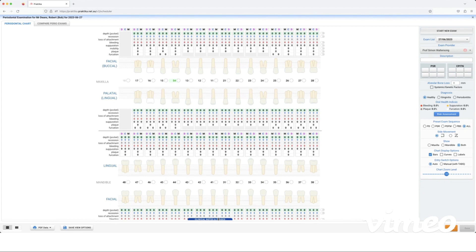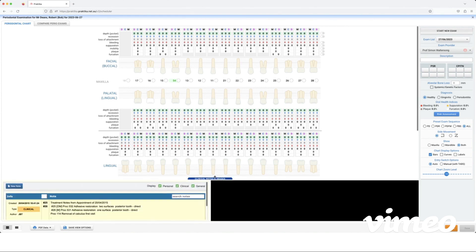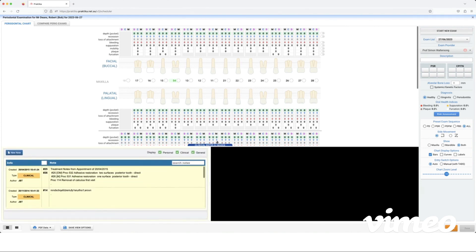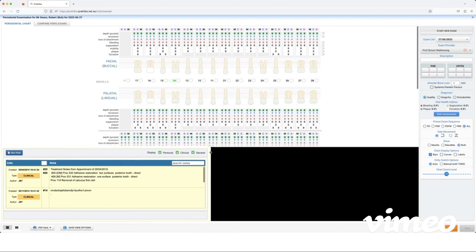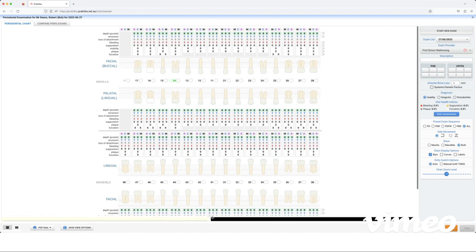We can drag our clinical notes and images up from the bottom of the screen by clicking this blue header and dragging it up. If I want to keep it here every time for the future under my user only, I can then press save view options. I'm just going to move this back down because I don't like seeing that.